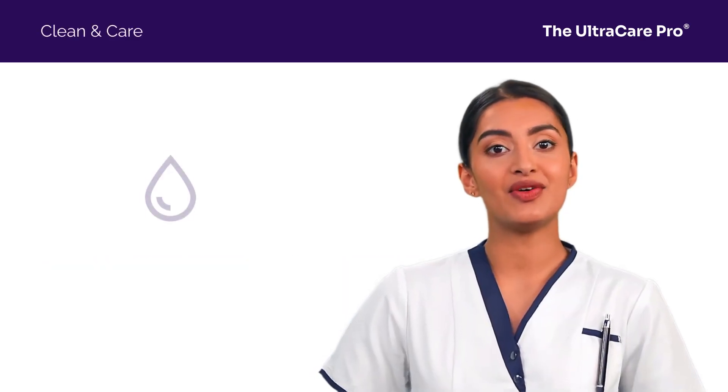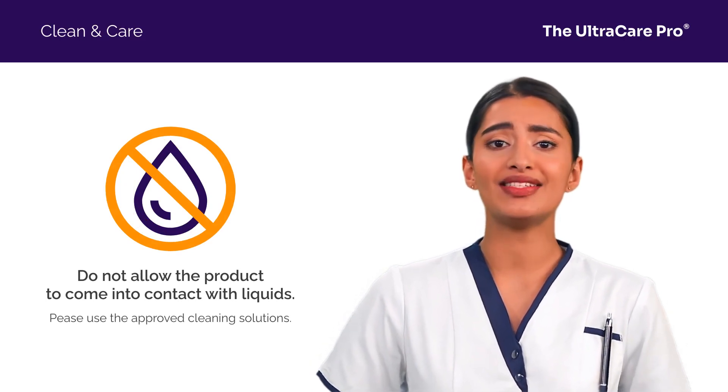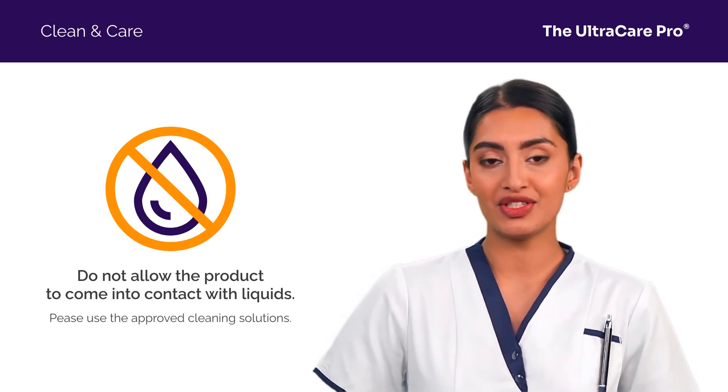First of all, never immerse the UltraCare Pro in water or any liquid. For the buttons and body, use the ultrasound-approved cleaning solution.